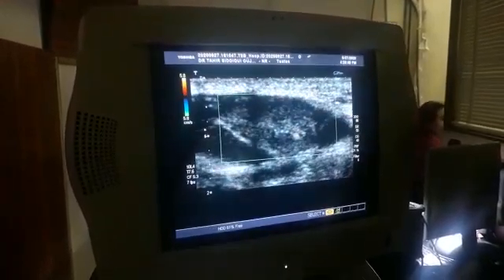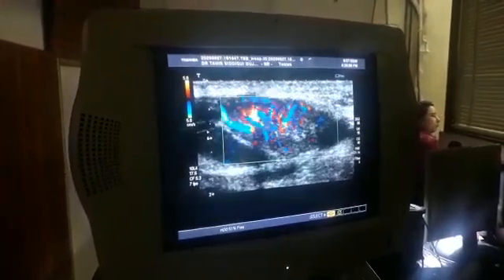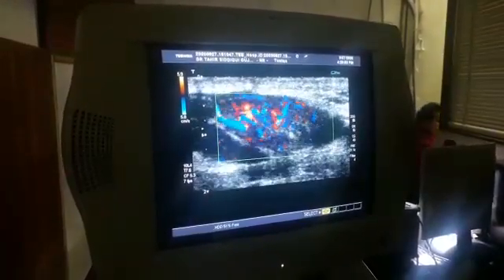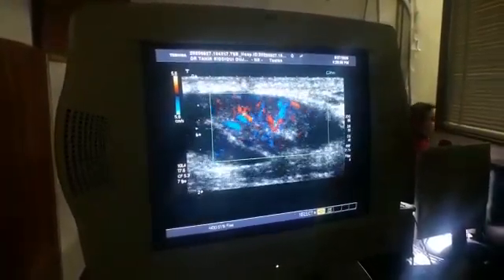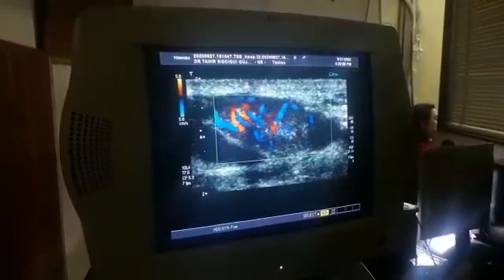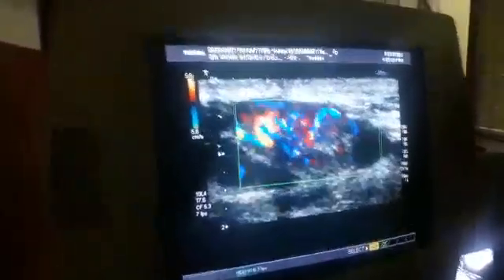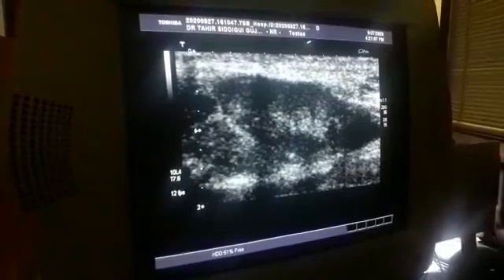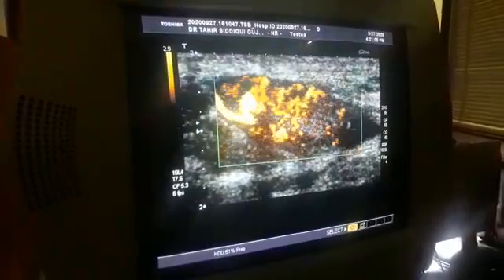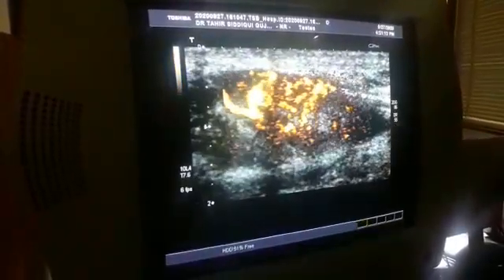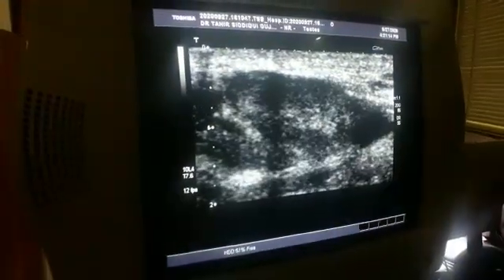Now the interesting thing is — see the degree of vascularity within it. No organ and nothing in this region will give you this much vascularity. So this is ectopic.